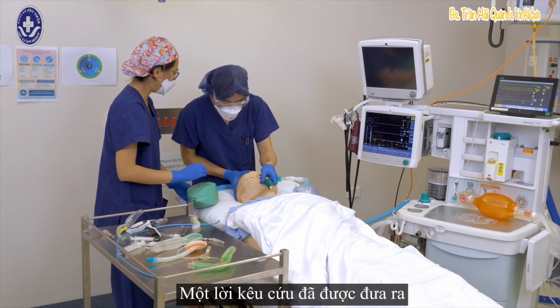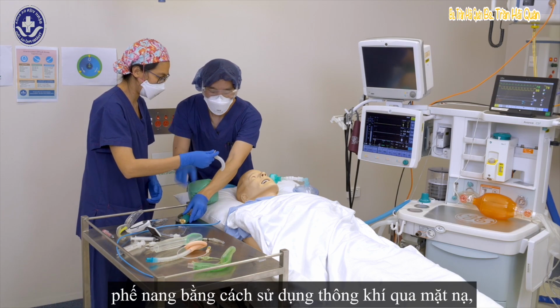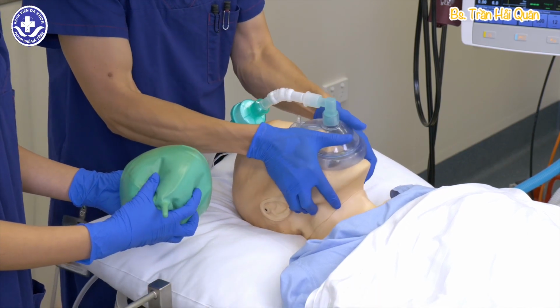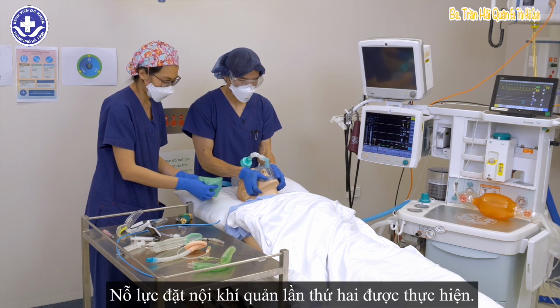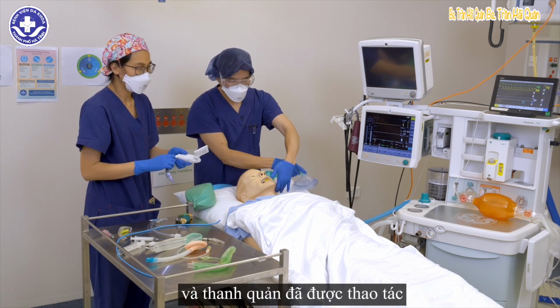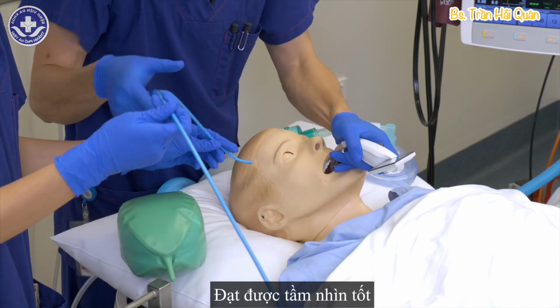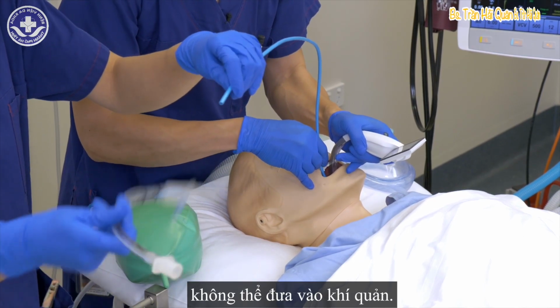A call for help has been placed, and the anaesthetist is now trying to achieve alveolar oxygenation using face mask ventilation, using his best attempt at ventilation. A second attempt at intubation is made. The patient is well positioned and the larynx has been manipulated, and a video laryngoscope is used. A good view is achieved, but the endotracheal tube is not able to be passed into the trachea.